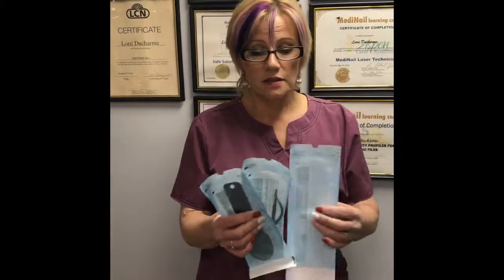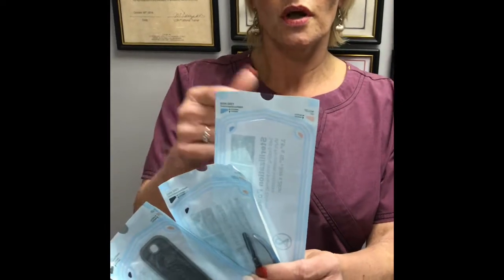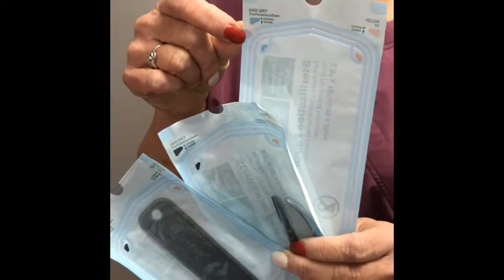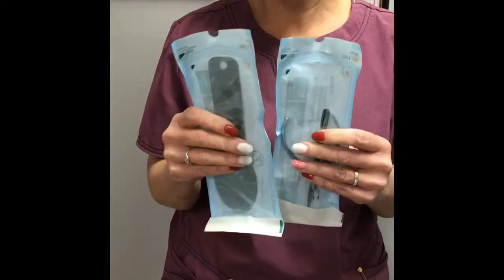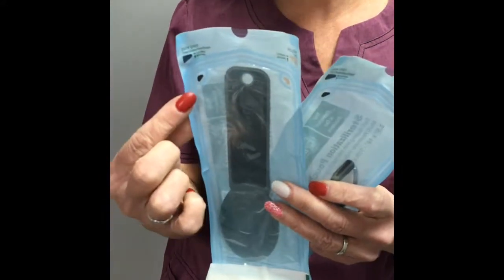There are a couple of ways I try to explain to people to look for the authenticity of these being used in an autoclave and not another unit. These autoclave bags, when run through the high-pressure steam sterilization, have indicators on them — a blue and a pink indicator strip that will show whether they've reached the correct steam temperature inside the autoclave, and they will change color. A new bag is clear and not as crinkly. After being run through the autoclave for the correct amount of time, these indicator strips change to tan and brown shades from the pink and blue.